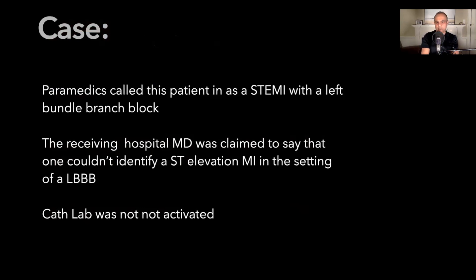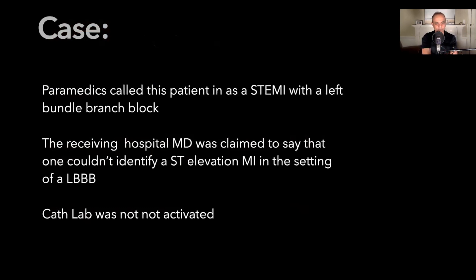The paramedics called this a STEMI with a left bundle branch block pattern. They called the receiving hospital, but the receiving physician claimed that one couldn't really identify an ST elevation in the setting of a left bundle branch block pattern.